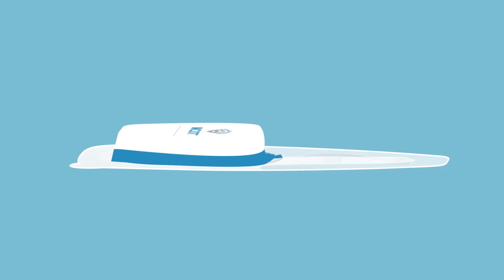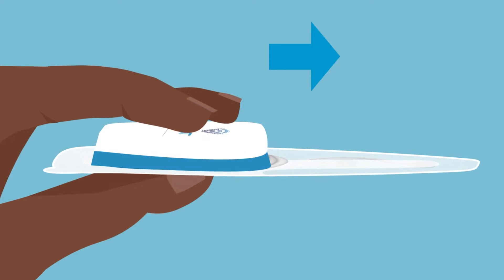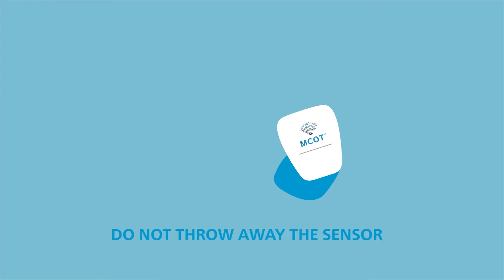Now that MCOT has been removed, you will need to remove the sensor from the patch. Apply downward pressure on the blue tab to snap it off — this may require some force. Next, hold the sensor as shown and gently slide it towards the tab to remove it from the patch. After the sensor is removed, discard the used patch but keep the sensor.